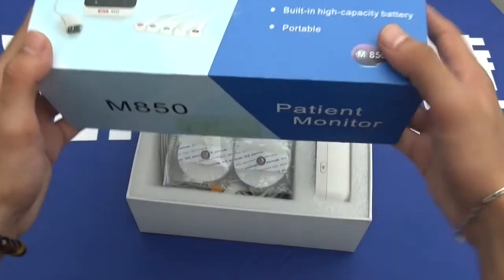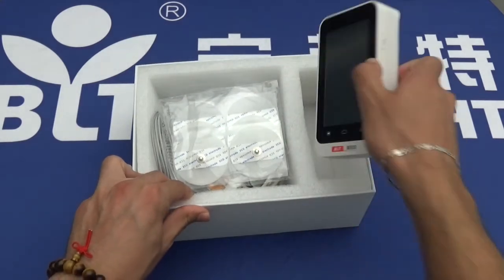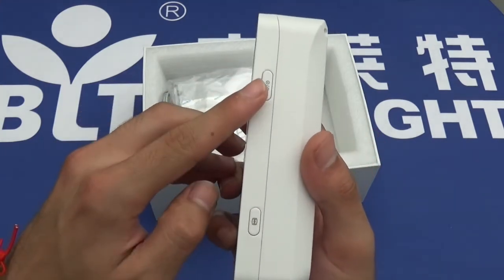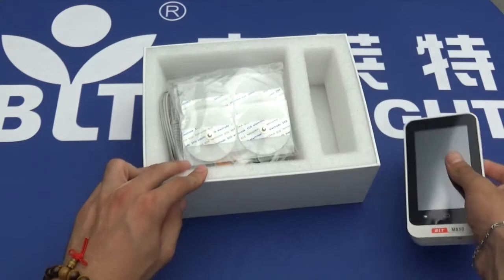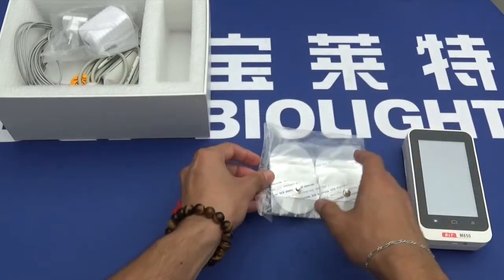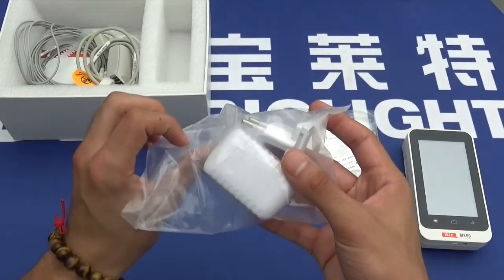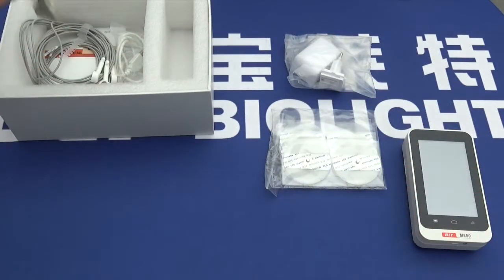Upon opening the box you'll find many items, including firstly the device itself, the speaker, the on button, the functional button, the ECG stickers themselves, the power brick, the wall plug, and the SPO2 sensor.